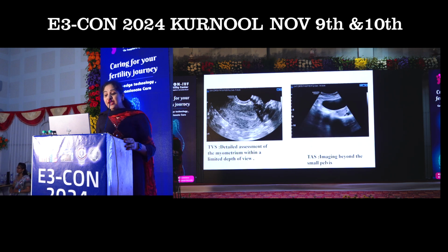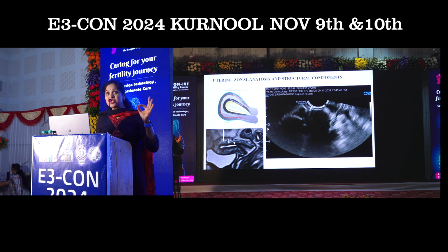And at this point, I would always emphasize, never hesitate to stop at the imaging because this is it. You should always take help of MRI in case the ultrasound doesn't suffice, because the aim is complete anatomical characterization before clinical decision is made. Now, what can you look into when you do a high resolution dedicated protocol imaging?